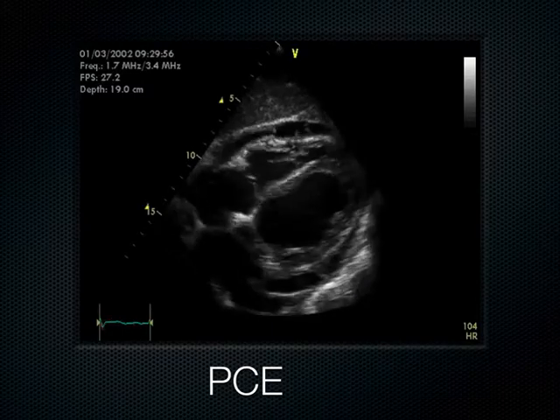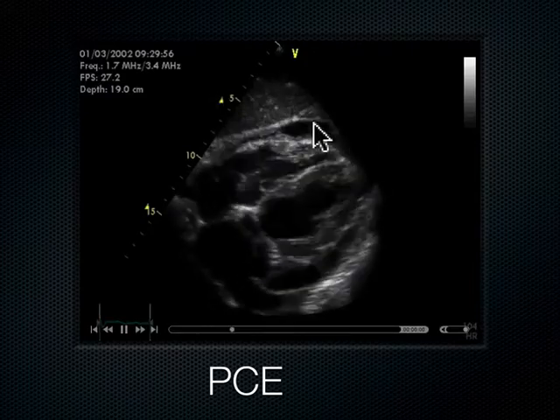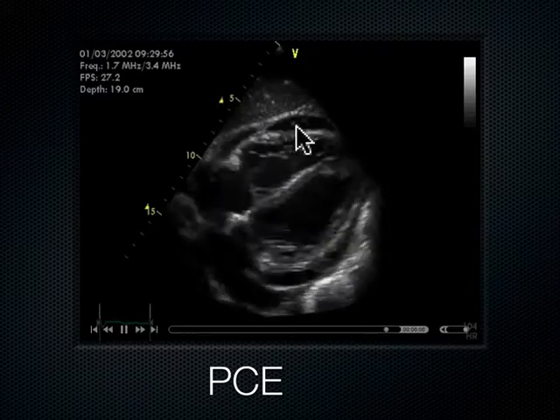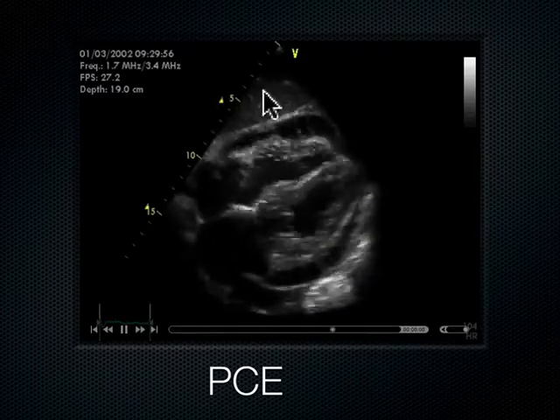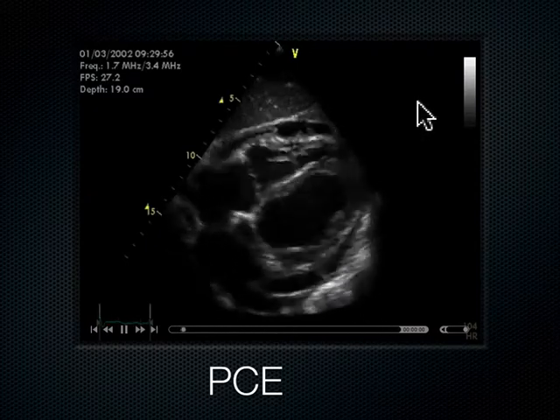This is an example here of a pericardial effusion. We can see that there are some loculations going on out here in this pericardial effusion. Here's the right ventricle, left ventricle. This is all the liver seen up here. Just an example here. This is probably a chronic effusion.